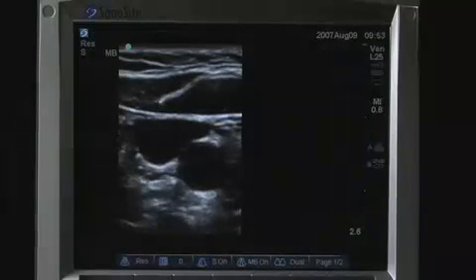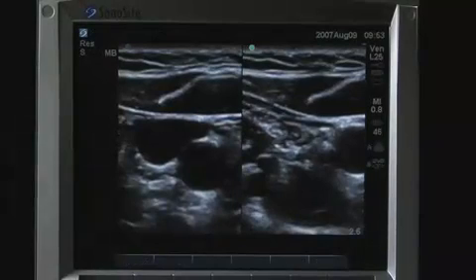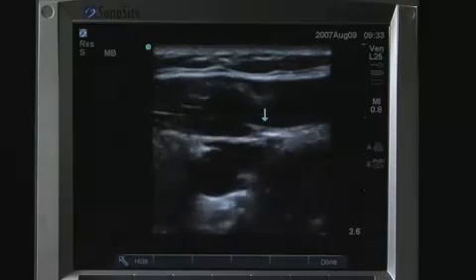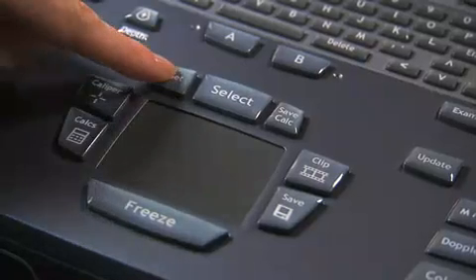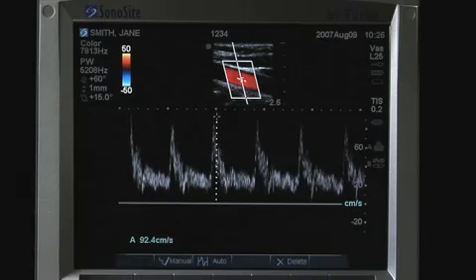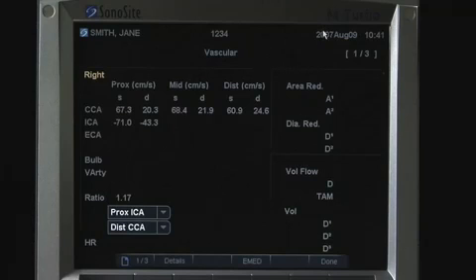The Select key also switches between frozen images in duplex and dual screens, pictograph marker position, and arrow position or orientation. On either side of the Select key are Set and Save Calc. The Set key confirms caliper location for measurements, and the Save Calc key transfers the measurement to the patient report.